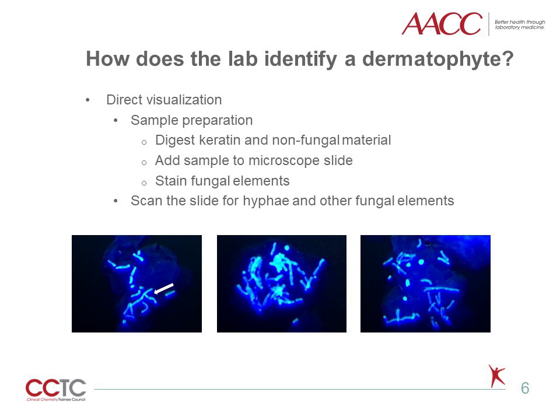The slides are viewed under a fluorescent microscope and scanned for evidence of a fungal infection. The images below show a positive KOH from a skin scraping, and you can see several examples of hyphal elements fluorescing. Septations, or the divisional lines between fungal cells, are visible, and the white arrow is pointing to an area of branching. Since molds can take several weeks to grow, this quick tool is very useful to the clinician and could aid in quickly guiding treatment. However, it is not possible to identify the microorganism to the genus and species level through this method of examination.